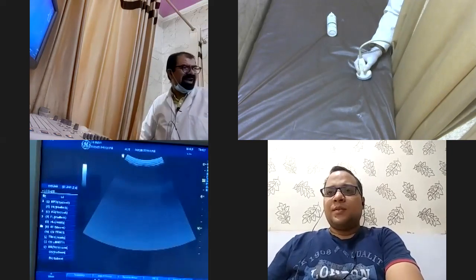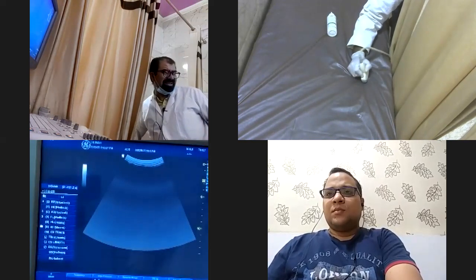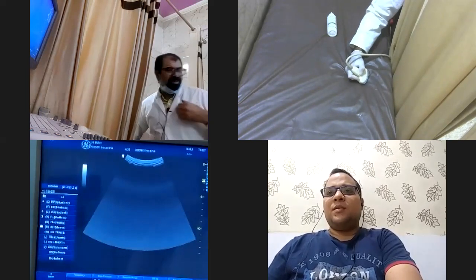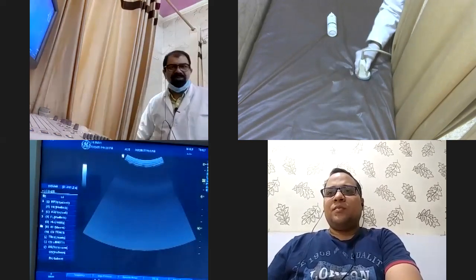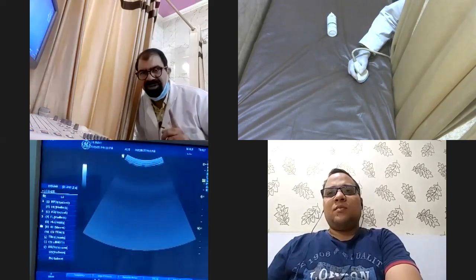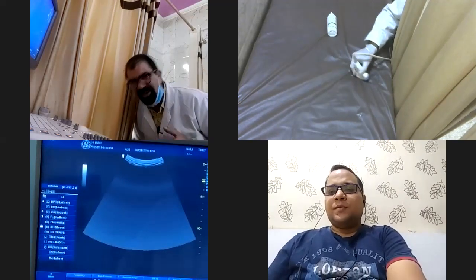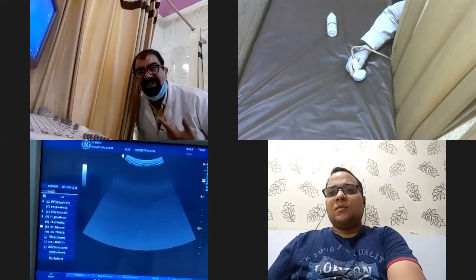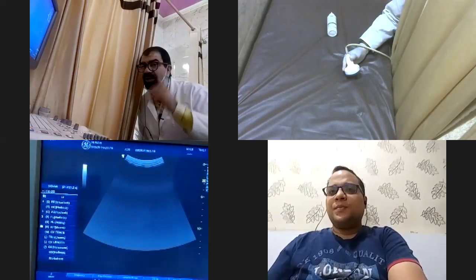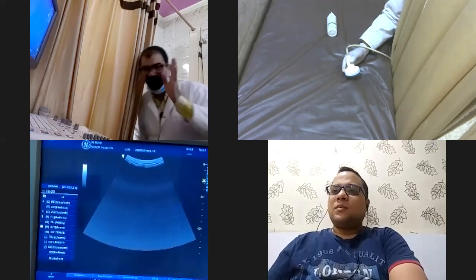But with anti-clockwise rotation, I will be having a grip on the patient. Now see, I personally am comfortable with anti-clockwise rotation, but again, I'm repeating, I am leaving it up to you whether to rotate clockwise or anti-clockwise. You will see for yourself what you are comfortable with, but provided you know what you are doing and how that will tell on the screen orientation. Done?